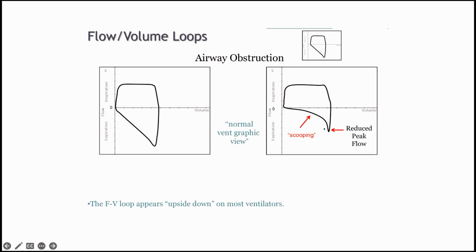the peak is reduced. Not only that, there is a scooping happening. It is supposed to be very characteristic of severe airway obstruction. That is what is being depicted. The peak expiratory flow is low, and the flow is also really slow. You can see that it is not very straight. It is slow, and a scooping kind of flow is happening in a severe obstruction. This airway obstruction is happening.